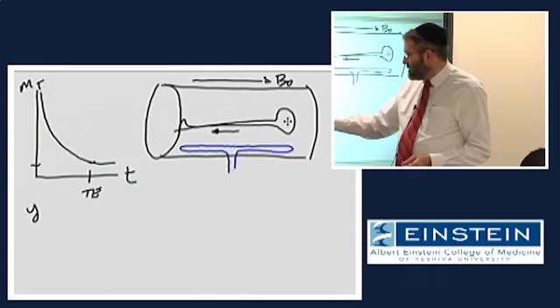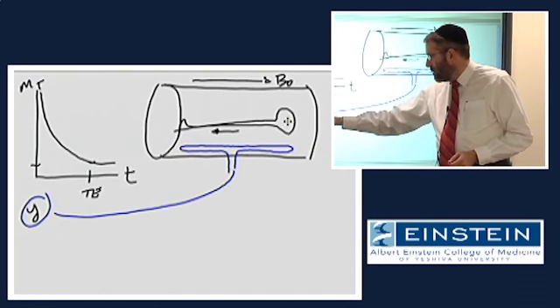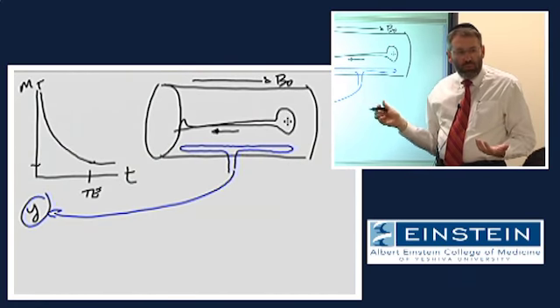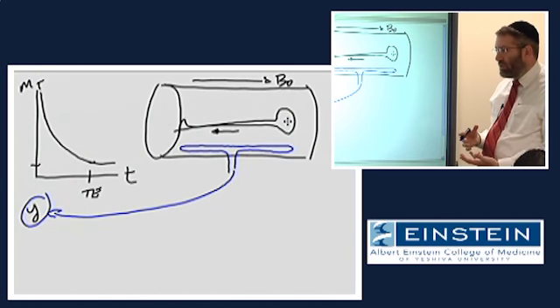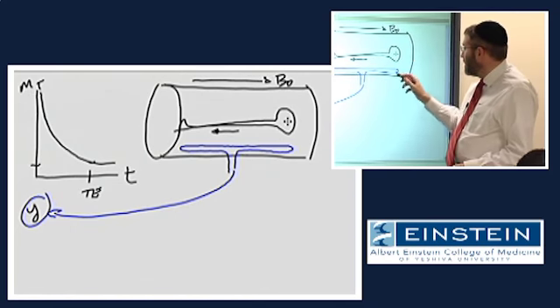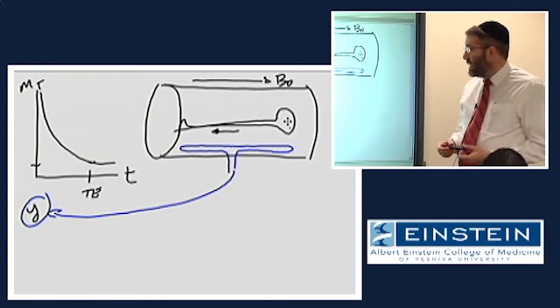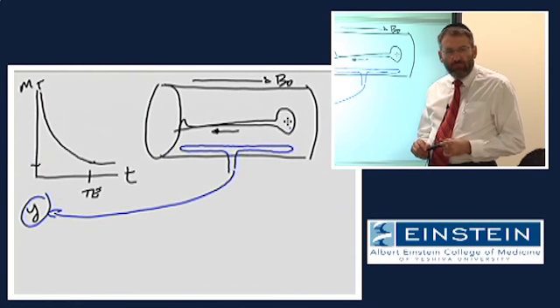So in this case, the signal that we detect comes from all of the spins, all of the water protons, anywhere in the body. And it's essentially a summation of all of that signal. We have absolutely no way of telling how much of it comes from the brain, or the heart, or the liver, or the toes, or wherever. It's coming from everywhere. And that's really not such a useful piece of information.